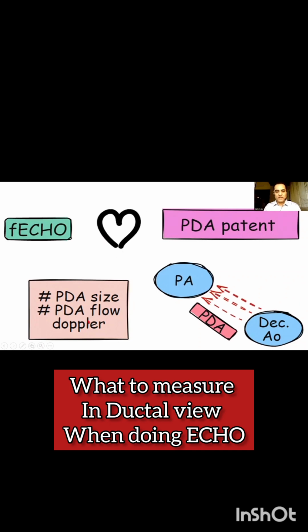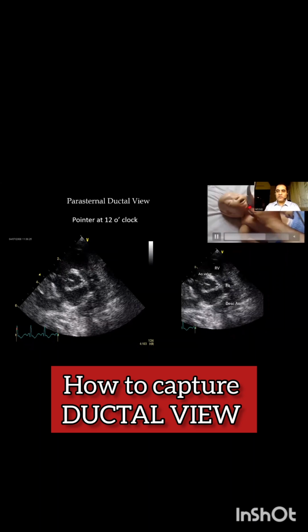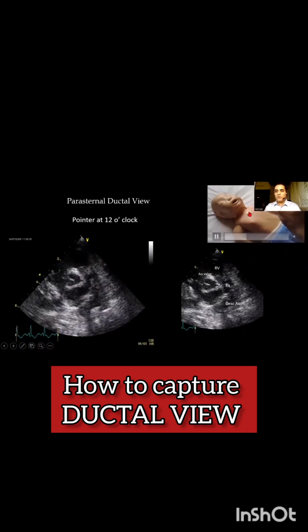Why we want to know this? Because it is important in the echo to know the size of the PDA, and then to see the blood flowing through the PDA, and do its dopplers. It is very important to make the assessment whether it is HSPDA or not. In this you will be seeing how to take the ductal view.